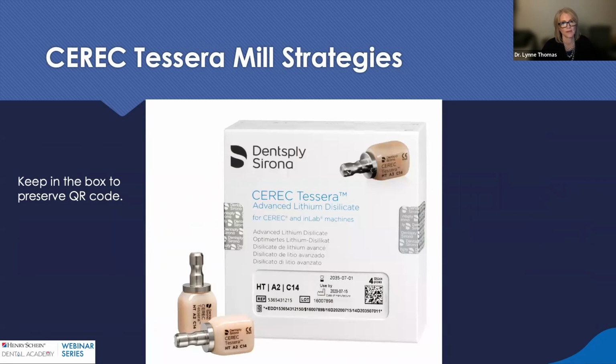So one of the things that I noticed with Tessera is you definitely want to leave it in its packaging if possible. You know, we're pretty tight with our space, so sometimes we will put our blocks in one of those organizers so we can just open it up and we know what colors we have without having to pull those boxes out and see what my inventory is.